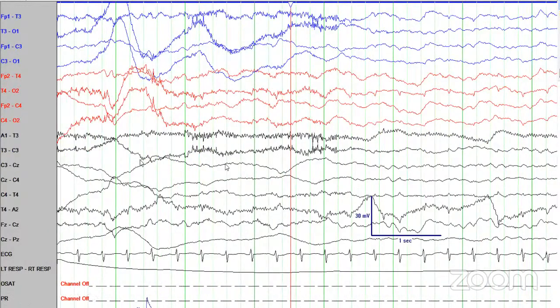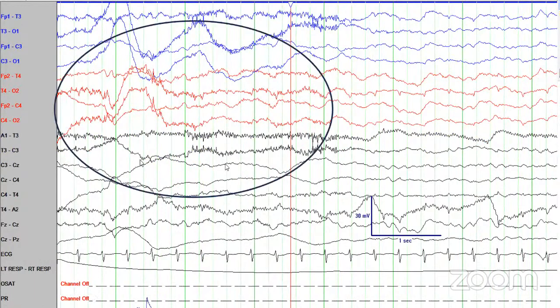Now, when we look at this, suddenly we find too much sinusoidal activity happening. This is actually a perspiration artifact. As Dr. Juhi had already mentioned, we record these activities on the EEG, which is basically a difference between two nearby electrodes. Now, if for some reason these electrodes do not tend to have that difference, then the most logical thing to appear would be a flat line, because there is no difference between the two electrodes.